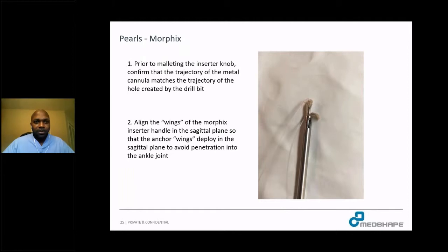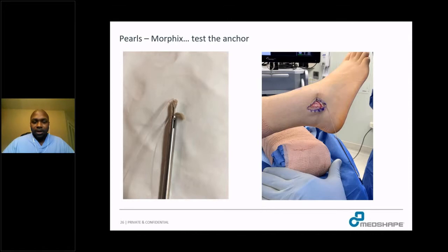A few pearls about the Morphix. First, confirm the trajectory of the metal cannula prior to inserting and malleting the implant. Make sure the wings and eyelet definitely go into the tunnel prior to deploying. The wings of the Morphix inserter match the wings of the implant, so you want to orient it in the sagittal plane — when the wings deploy in the sagittal plane, you can avoid penetration into the ankle joint. And as I mentioned, feel free to test the anchor; I lifted the leg with the anchor, which just goes to show that I trust the implant.